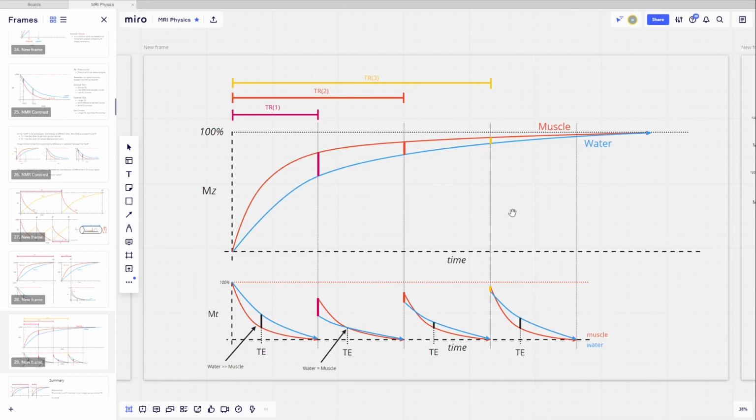The amount of contrast from the longitudinal relaxation, which is this little yellow bar here, is shown here. It's not making as much of a contribution to these curves. Okay, so this with a long TR actually looks mainly like this, where you're maximizing your T2. So one of the trends I want to point out is that with a short TR, you're really maximizing the amount of information about differences in T1 that show up in your final signal curves.